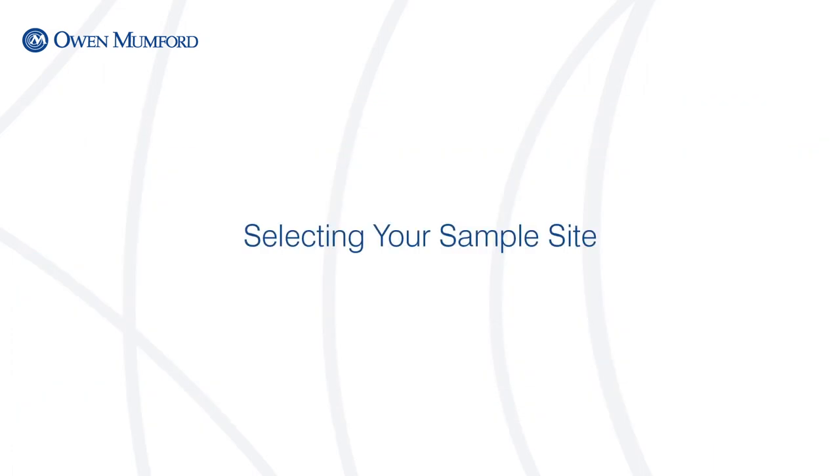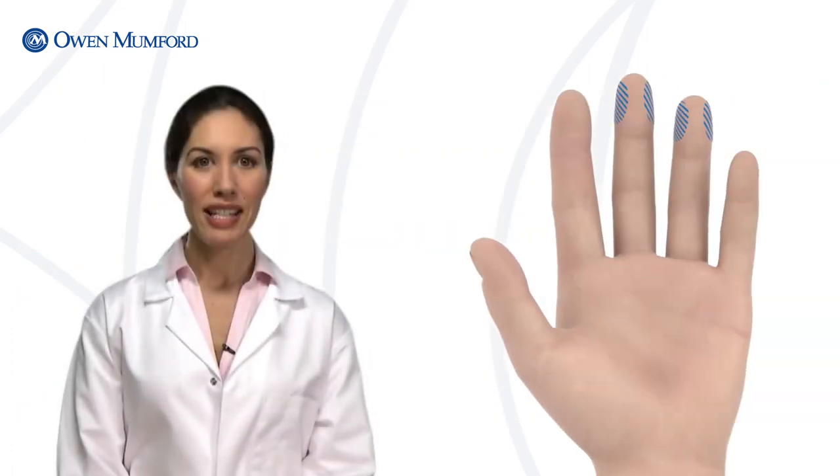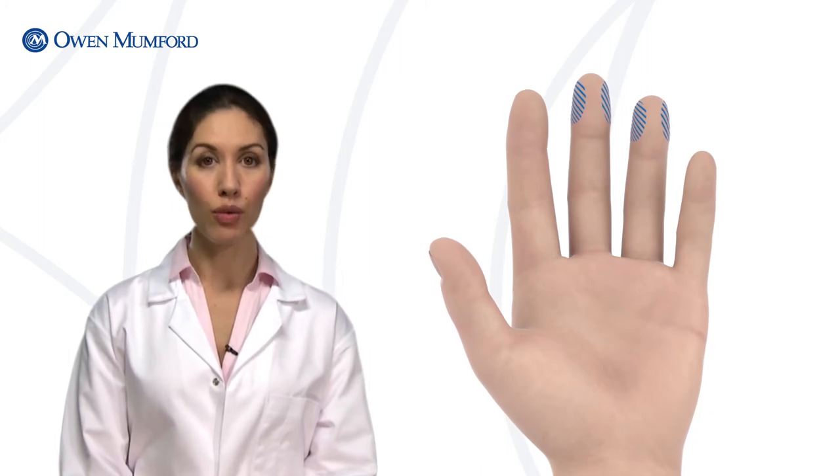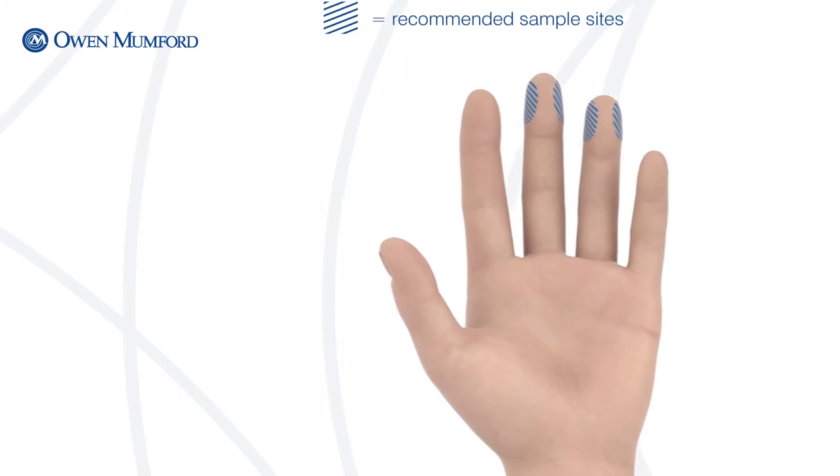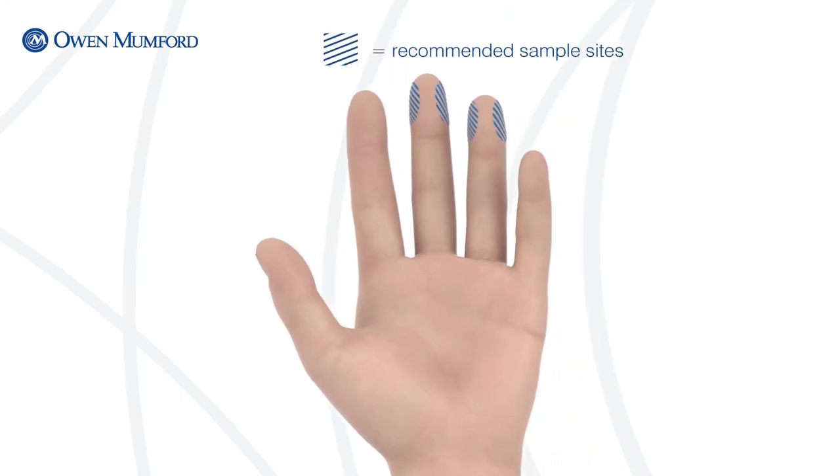When performing a finger stick, site selection is critical. Testing should be performed on the middle or ring finger of the non-dominant hand. A viable testing site will appear warm and pink in color. The puncture should be made slightly off-center within the fleshy part of the fingertip.